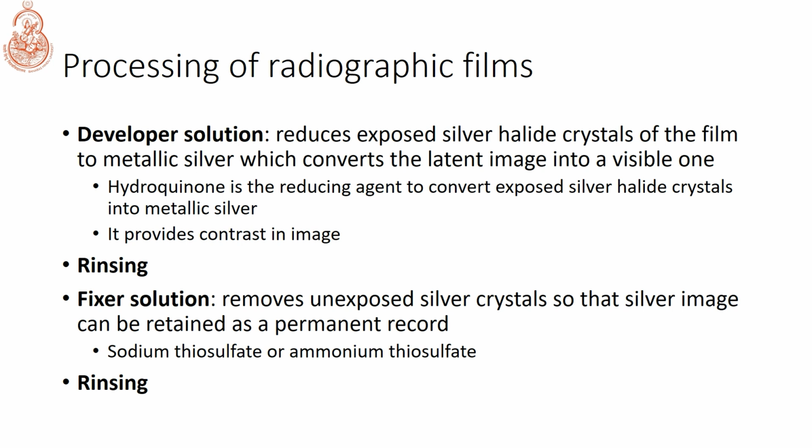The reducing agent present inside the developer solution is hydroquinone. This hydroquinone is responsible for converting the exposed silver halide crystals to metallic silver, and this developing provides the contrast of the image.